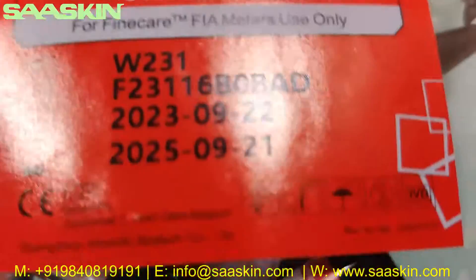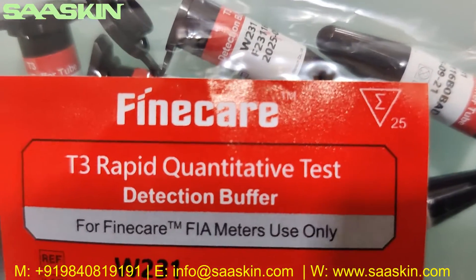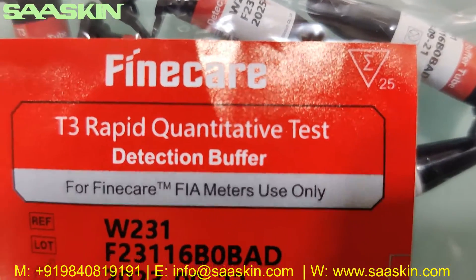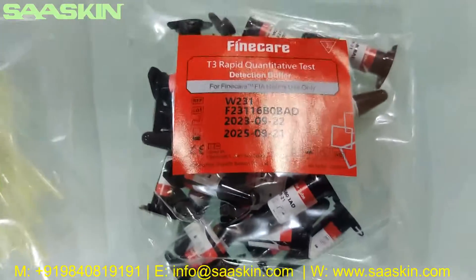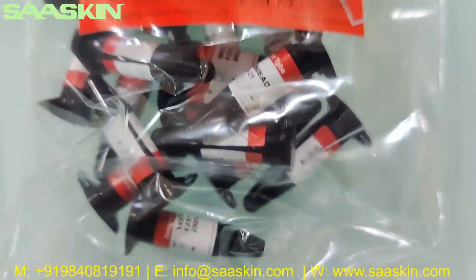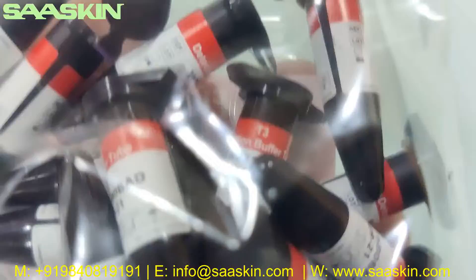Let's check the buffer. It says T3 Rapid Quantitative Detection Buffer. You can see the reference part number, lot number, manufacturing date, and expiry date. This is how it looks — 25 individual buffer tubes.